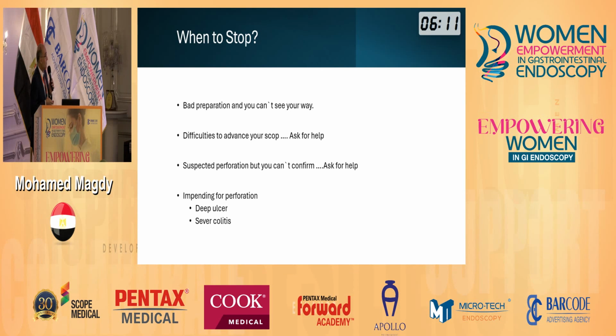Bad preparation of the patient. When you are doing a colonoscopy and you cannot see well, if you push against resistance, you have a high rate of complications. It is sometimes difficult to advance the colonoscope due to tortuosity of the colon, especially in the area of the sigmoid, where you have some resistance. Please don't push against resistance, and ask for help.